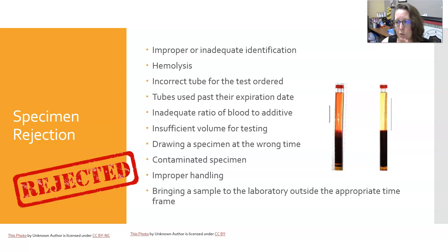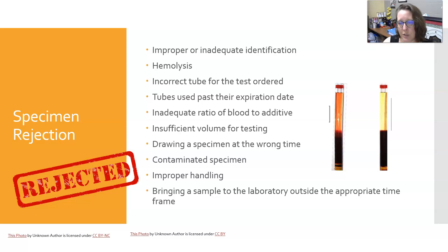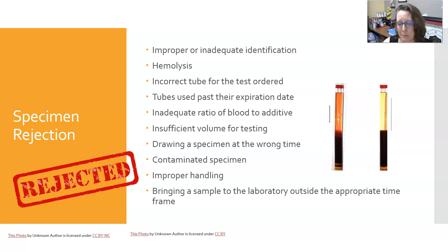If the incorrect tube was submitted for the test ordered, that is a reason for rejection. Tubes are often not interchangeable, and it is not appropriate to pour blood from one tube type into another — it must be collected in the correct tube. Tubes used past their expiration date can cause incomplete fill and improper preservation. An inadequate ratio of blood to additive — especially for blue tops — can cause erroneous results. Insufficient volume for testing or a specimen drawn at the wrong time are also reasons for rejection.